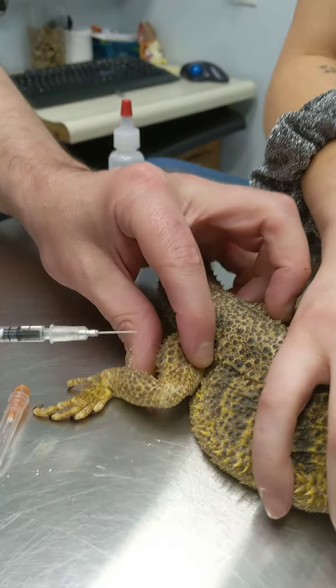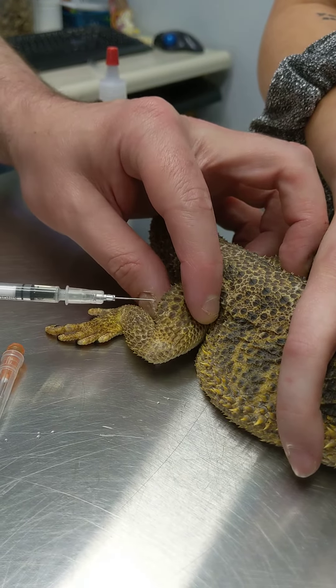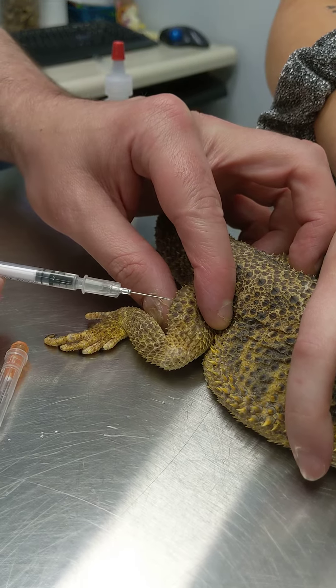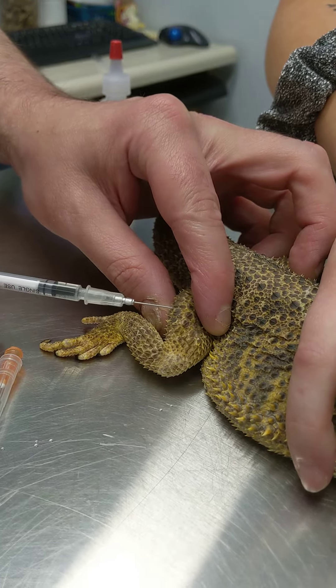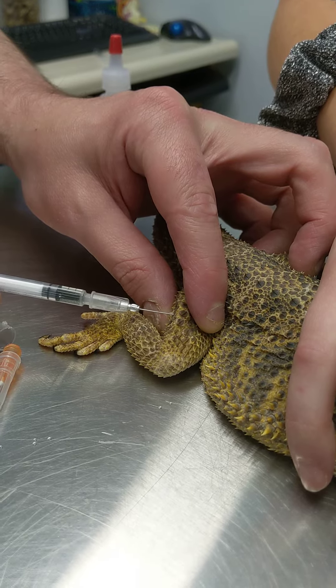In this case, listen to whoever tells you where to give it, but most of the time we're going to be giving it into the limbs. I'm doing this in the back leg. I'm going to aim right between those scales, and I'm just going to push in until I feel it go through.